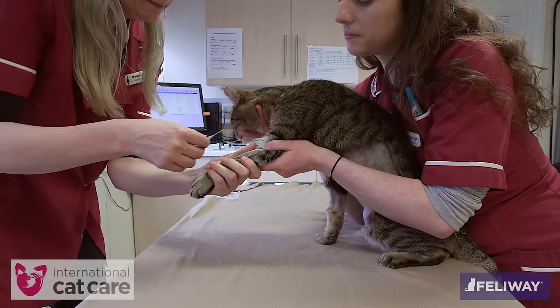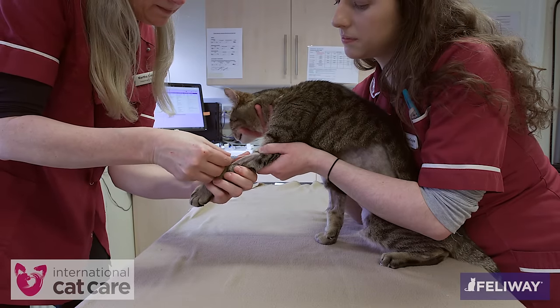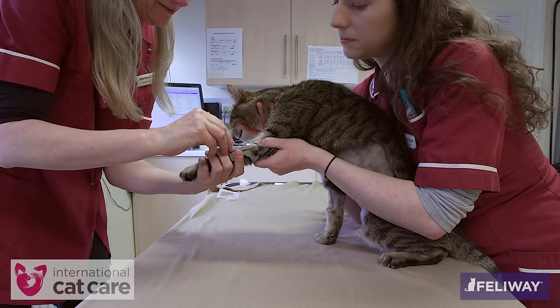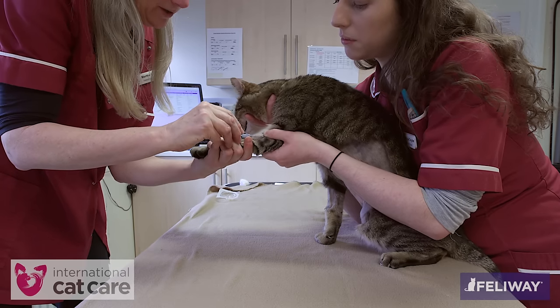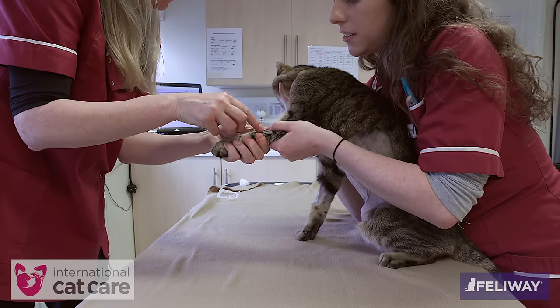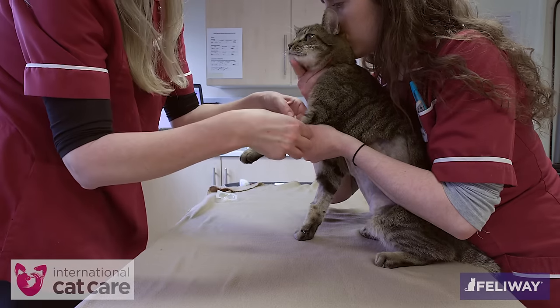After sterile preparation, the catheter can be placed. The assistant remains behind the cat, extending the elbow and raising the vein with her thumb, then using this thumb to occlude the catheter while a bung or connector is placed. Note that throughout, the cat is gently restrained, stroked, and spoken to with a quiet voice.